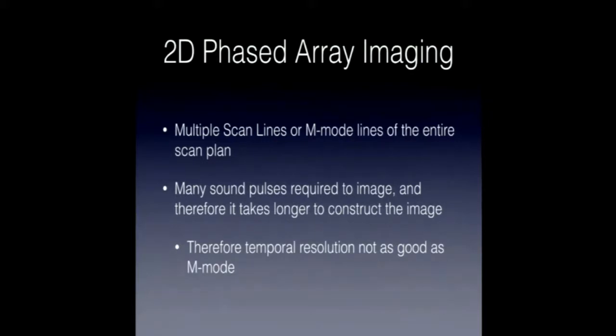Not that I know. It's typically done in short axis. In long axis, you can measure the end diastolic diameter of the LV, and you'd measure across the chordae tendineae between the papillary muscle and the mitral valve. So there are guidelines on where you should be measuring. And M-mode's a great way to measure. Rather than just push freeze frame and think, okay, probably I caught it in diastole. Well, if you M-mode it, you can then move along and say, that is exactly where it's widest. That's diastole. That's the measurement I'm going to use. So it's a really elegant thing to use.